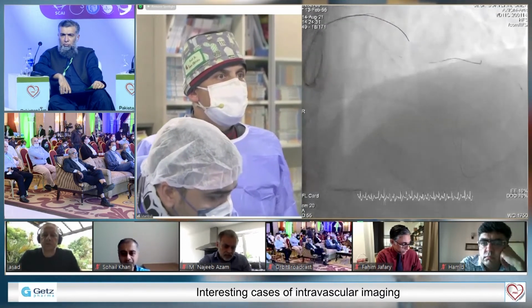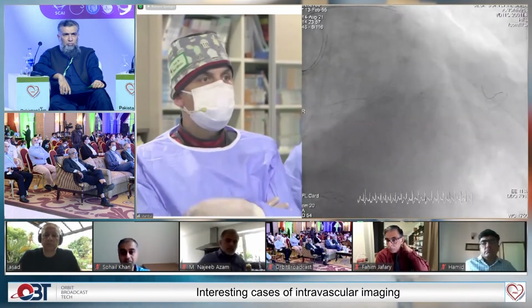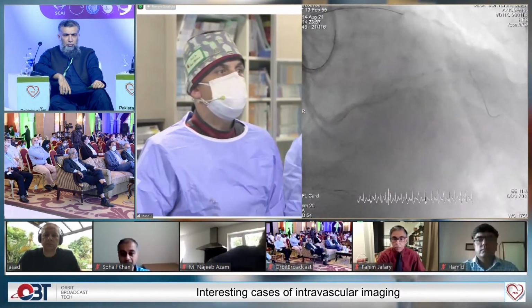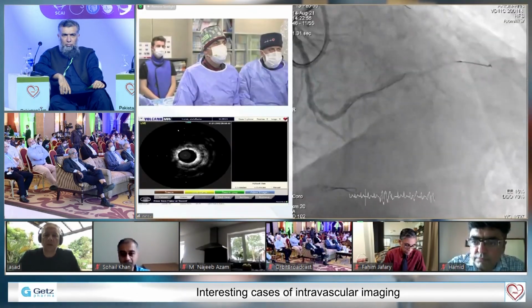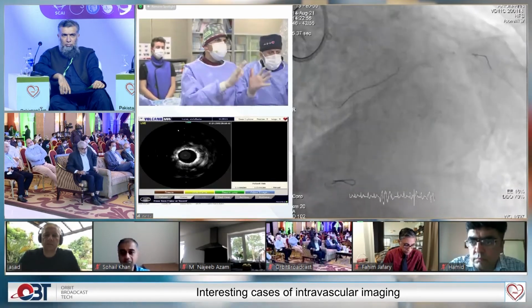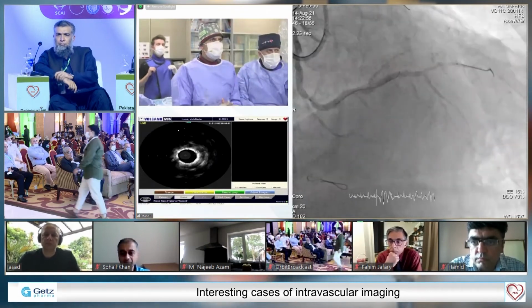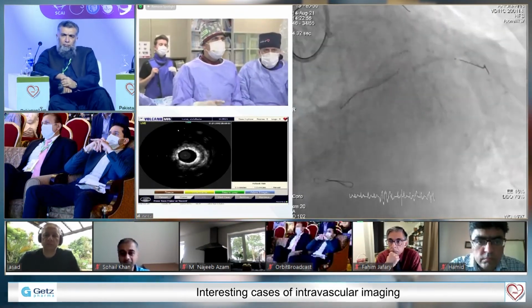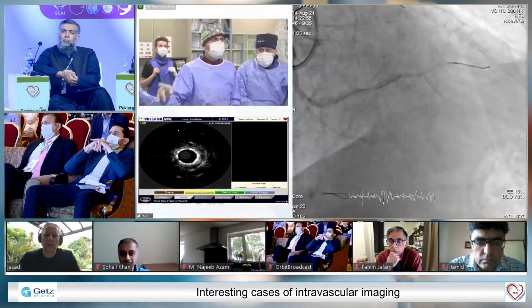Now, with the Fielder FC, we were able to cross. We left it from here. It wasn't easy. There are lots of side branches, lots of things there, but this one is Fielder FC, and it crossed that tortuous epicardial collateral.